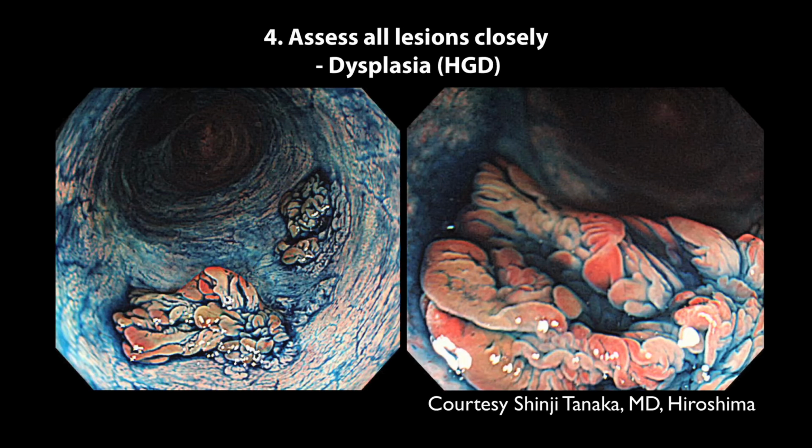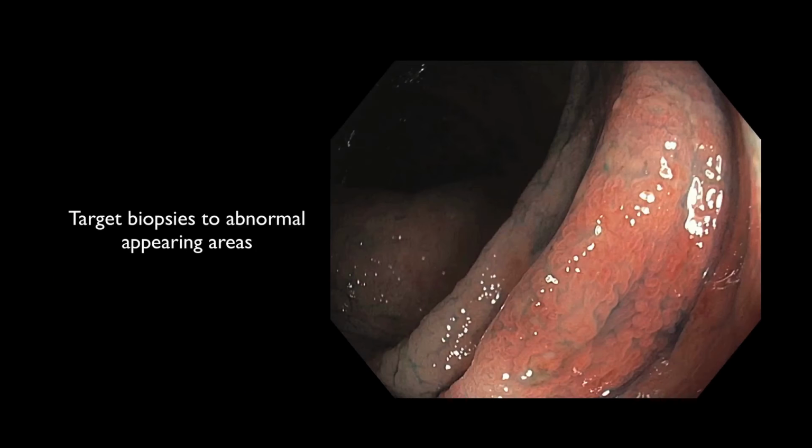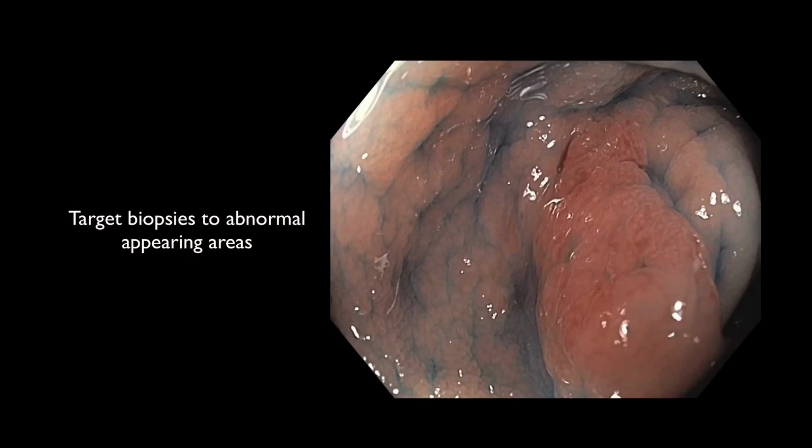The surface of neoplastic colorectal lesions in IBD is atypical, often with irregular shapes and patterns. Lesions that exhibit such features often harbor high-grade dysplasia, as shown in this case. Again, with the use of chromoendoscopy, biopsies can be targeted to visibly abnormal areas rather than randomly applied. We emphasize the importance to biopsy the abnormal area that appears distinct from surrounding mucosa.